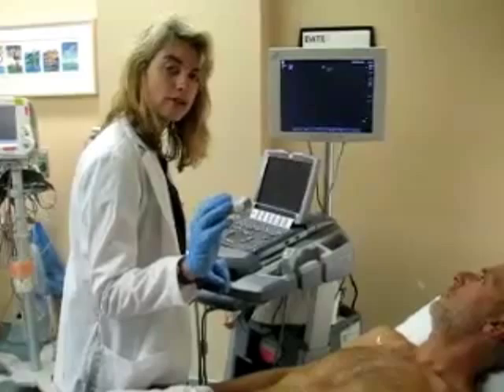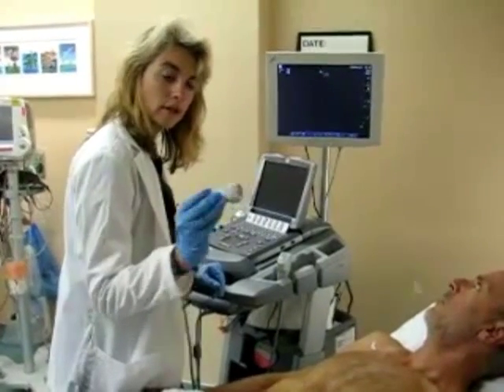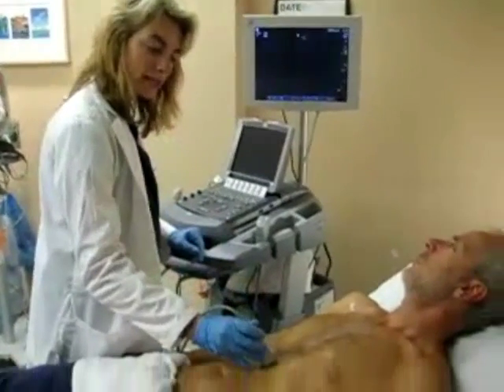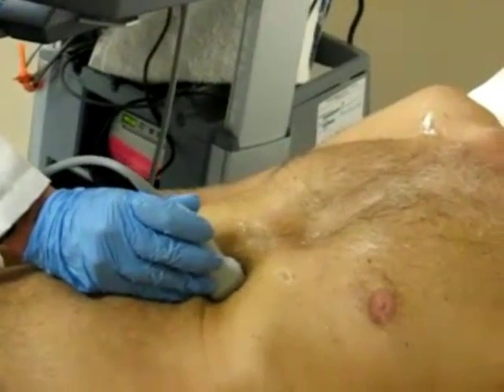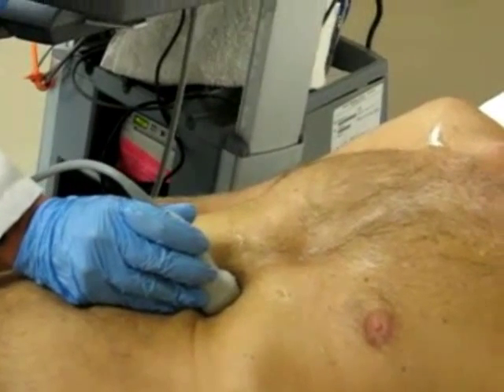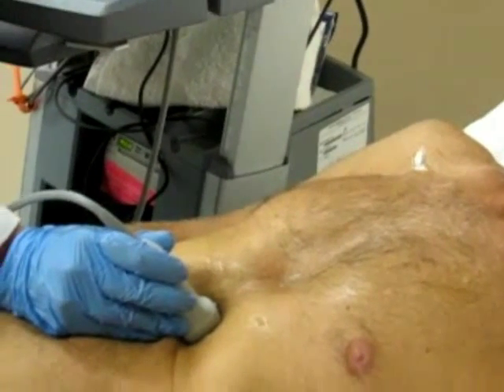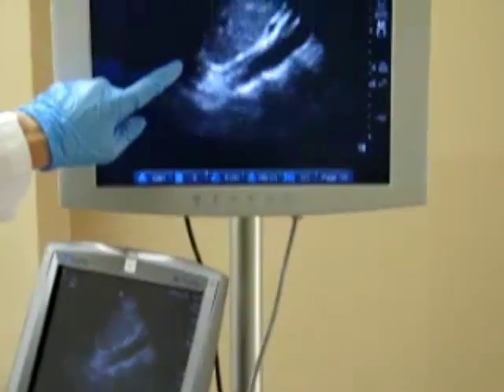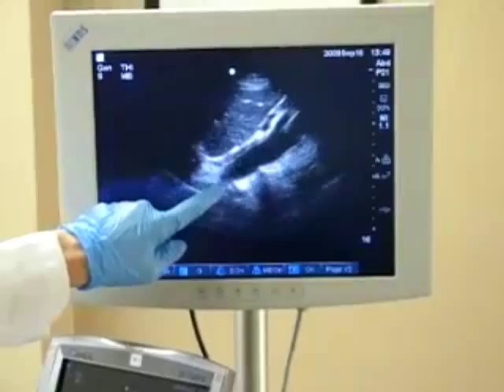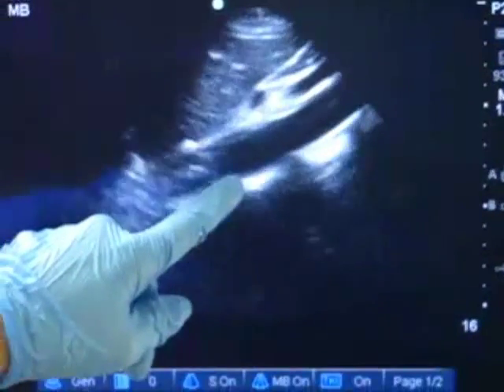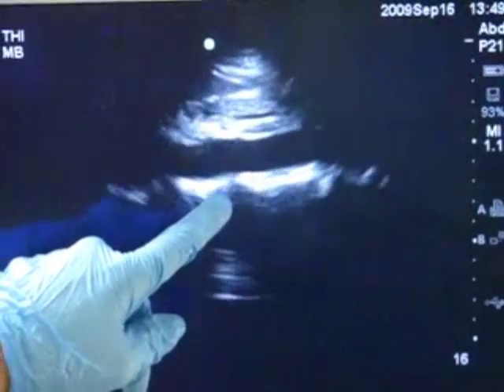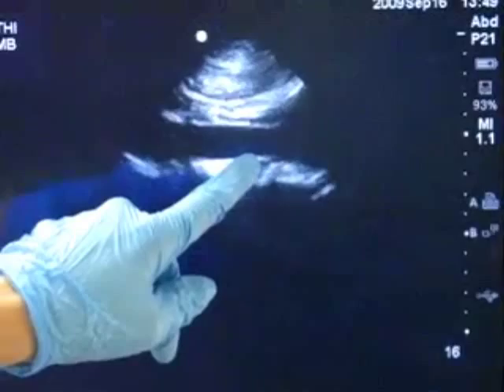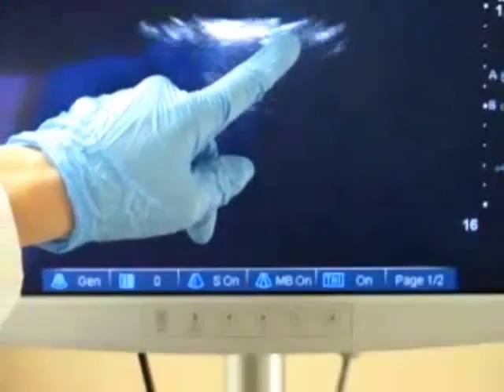In two orientations, both longitudinal and transverse, the probe is taken and placed in the midline of the abdomen, just below the xiphoid process, and aimed directly through to the back. On the monitor, the lower portion of the heart can be seen beating, and the aorta is coming down next to the liver. The probe is fanned down, assessing the aorta and its longitudinal track through the abdomen.